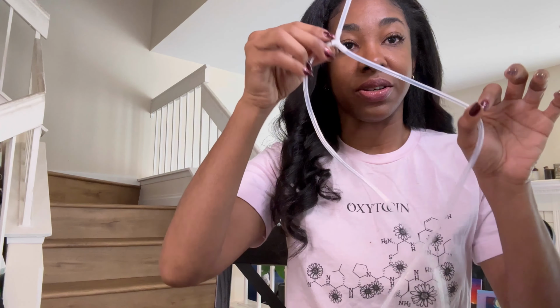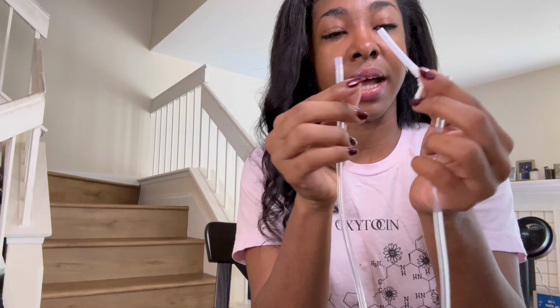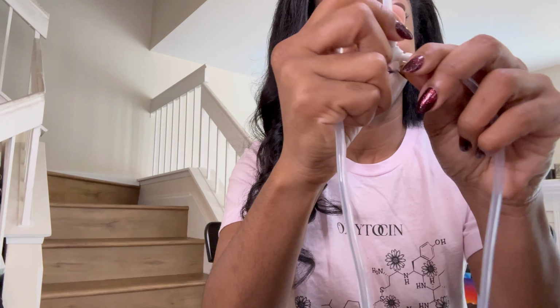Okay, so here's the tubing that it comes with. It comes with the standard Y tubing, which you see a lot for double breast pumps. I have already attached this, but just for purposes of showing you how it works, these will come unattached and you will need to attach them. So you attach these to here. Make sure they're on securely, because just like with your breast pump, if these aren't attached securely, the suction will not be adequate and it may not work efficiently or effectively for you.